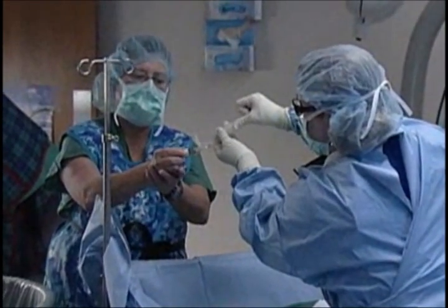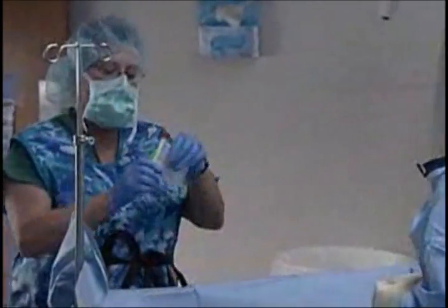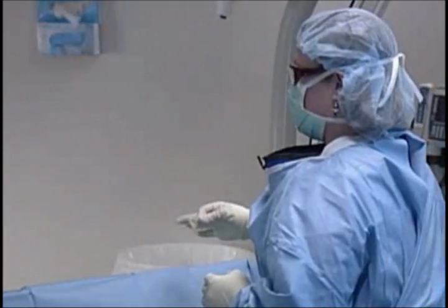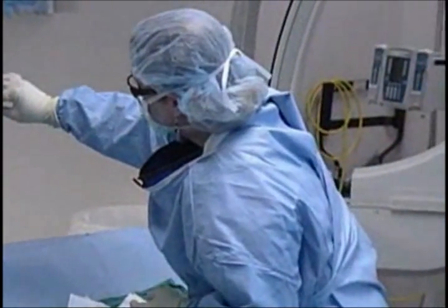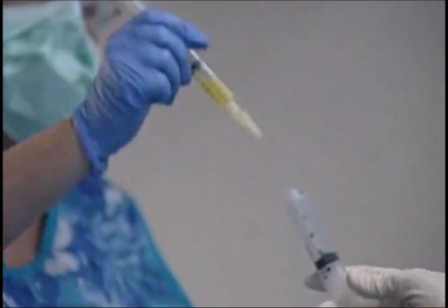The ethiodol is being drawn up now, and that's based on or derived from poppy seed oil. It has a consistency similar to olive oil. To allow good mixing with that oil-based contrast, the chemotherapy agents are mixed in a solution with similar viscosity, which involves contrast material and sterile water or normal saline.